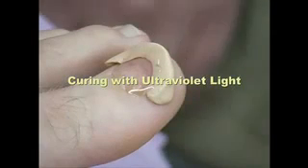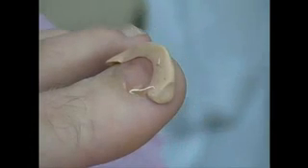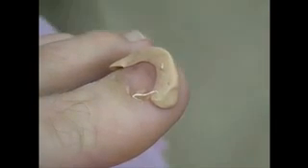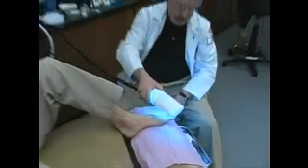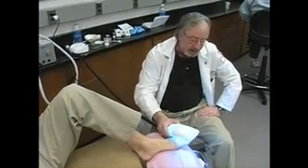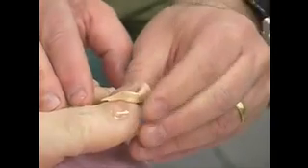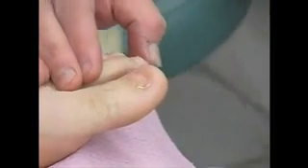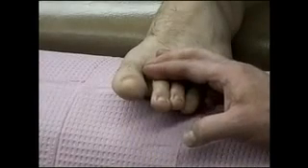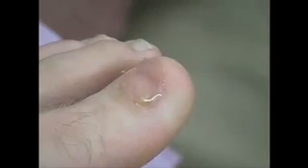Now this is the first layer. I'm going to go ahead and use the light and set this. Your red light has to be on, and then you're just going to hold this till the blue light, the ultraviolet light, comes on. You could set it with a stand, which is a little easier. Have an assistant help with this if you want. Now it's kind of nice here. You can see how easily your putty just pulls away, and it doesn't stick at all to the KeryFlex. So by doing that, we're able to build this out a little bit better.